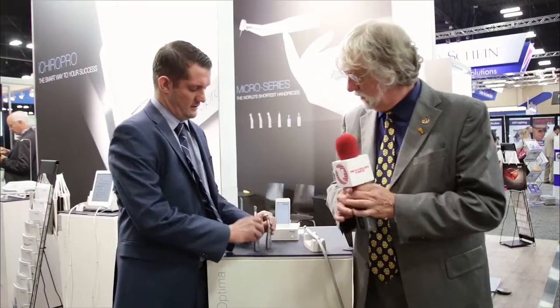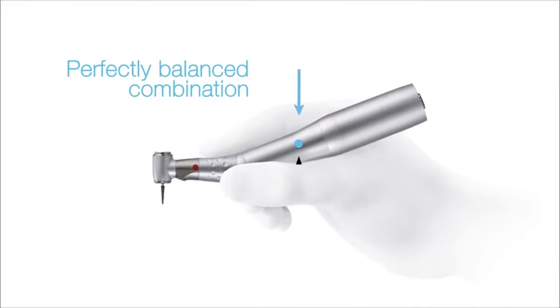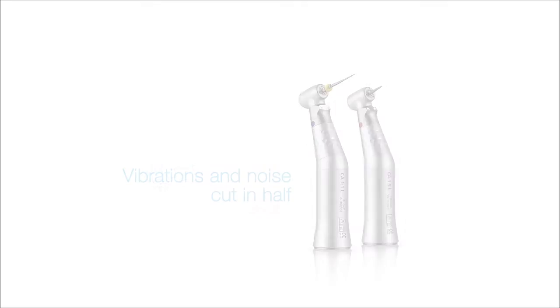One of the problems I had earlier on with electric handpieces was the size, and now they've shortened the whole thing. They have a short motor, a shorter overall system — much lighter, more ergonomic. We're very excited to introduce another first by Bien Air. We were the first to introduce a line of small contra angles. The combination of motor and attachment are the smallest in the world. This greatly decreases hand fatigue, puts the balance right in the center of your palm, making for a very efficient instrument.